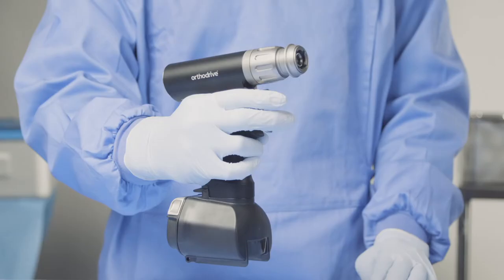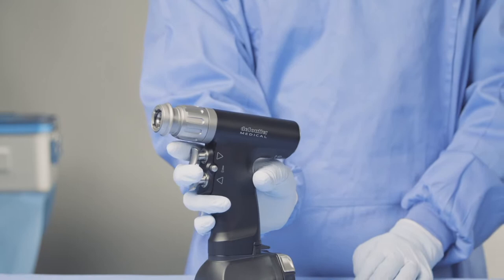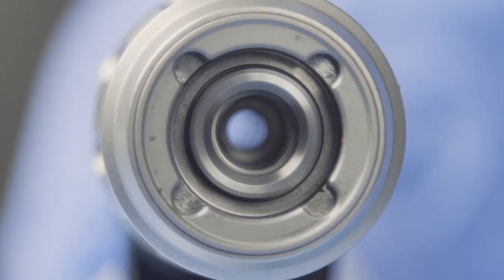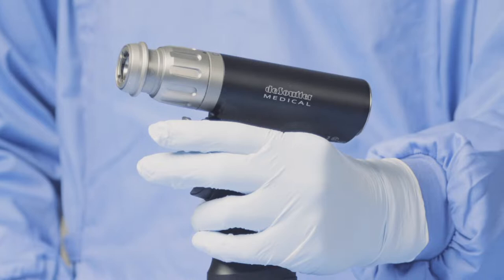Now if I show you the flip side of the tool, there's a small screw symbol. If you push the mode selector across on this side, you will get a low speed screwing function. This is not to be confused with reaming. This is mainly used for putting screws in on power.